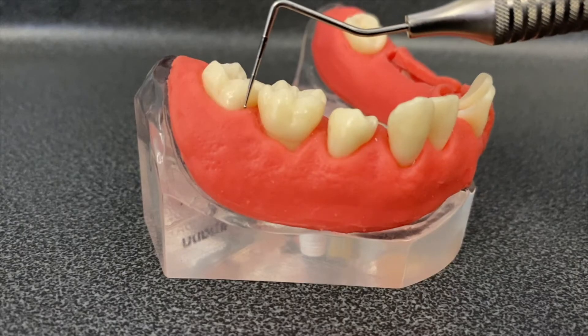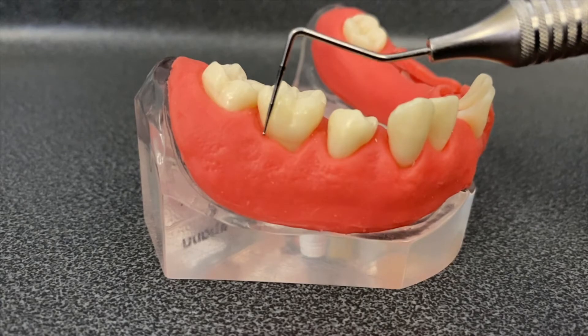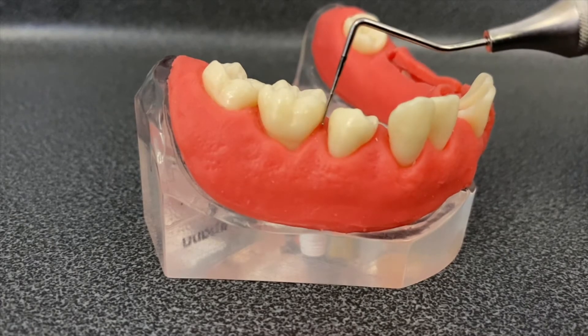In order to measure the BPE, the probe is walked around the teeth at all sides and a force of around 20 to 25 grams should be used. This is essentially enough to make the skin blanch underneath your nail. As the probe is being walked around, the worst BPE score should be recorded for that sextant.